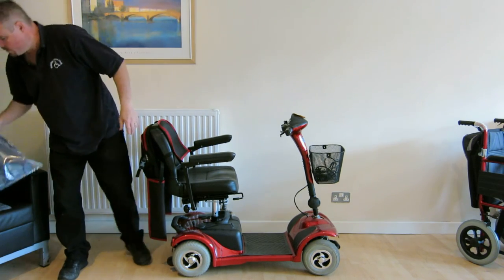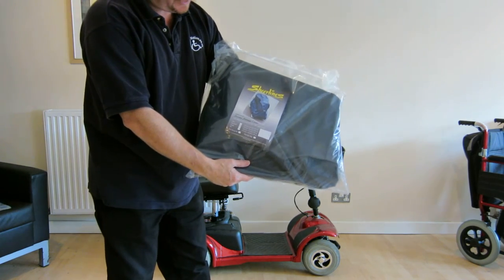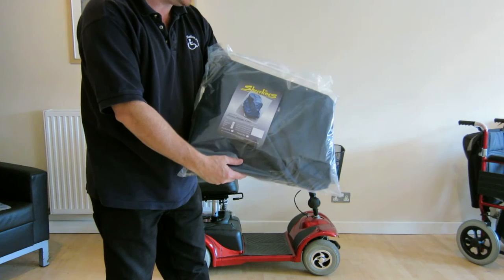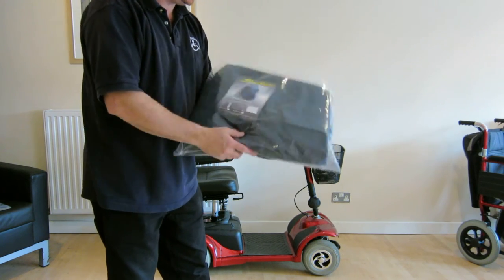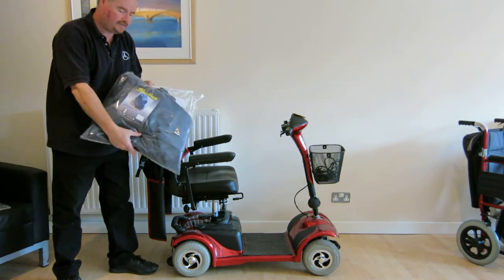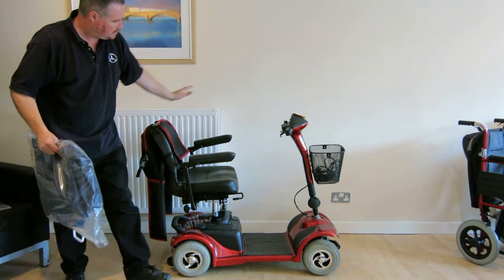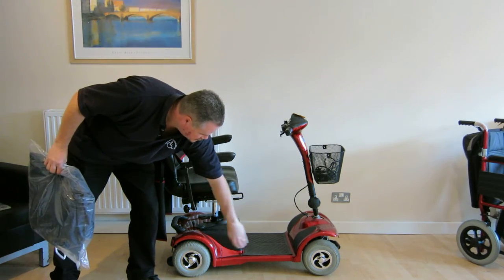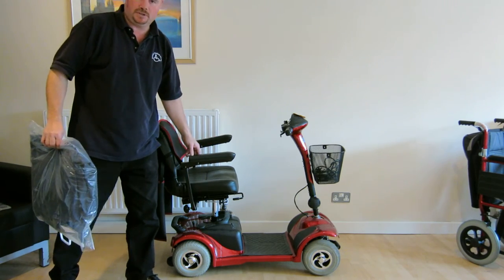We also have a range of storage covers that are designed to match the size of the relevant scooters. So this is one of the standard sizes — this will be suitable for this scooter. This is a PVC cover and it comes with an elasticated waist, so basically it covers the whole scooter and it stretches around the base of the scooter to keep it nice and watertight.